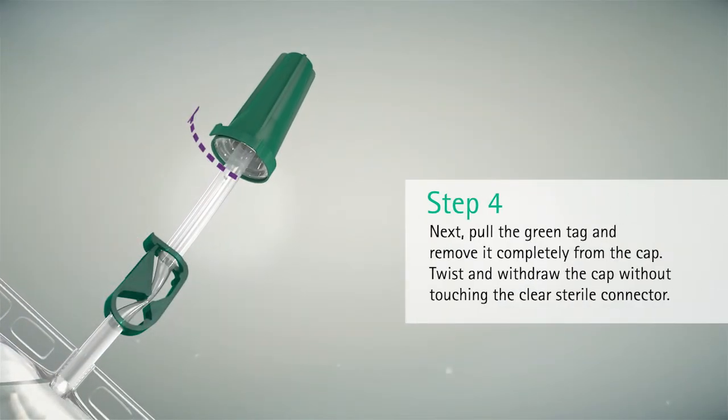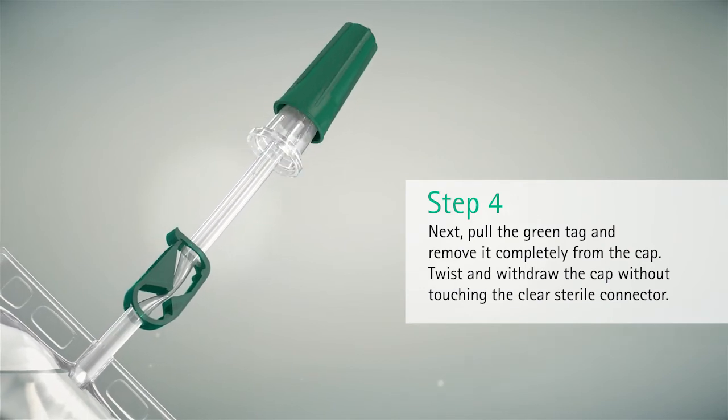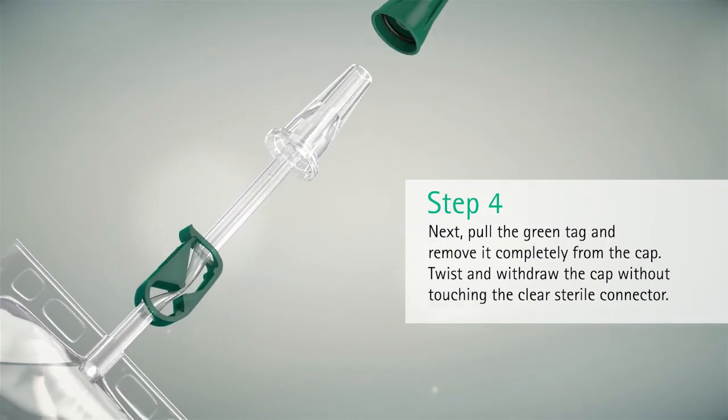Next, pull the green tag and remove it completely from the cap. Twist and withdraw the cap without touching the clear sterile connector.